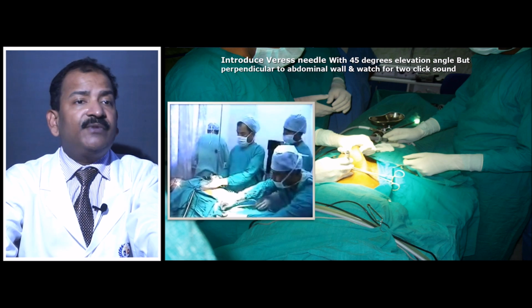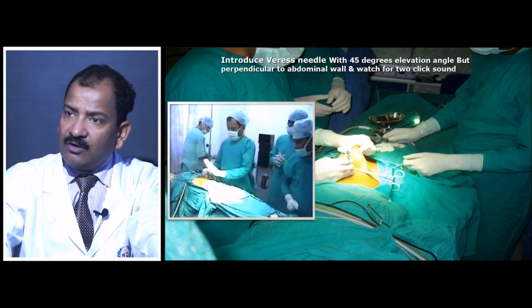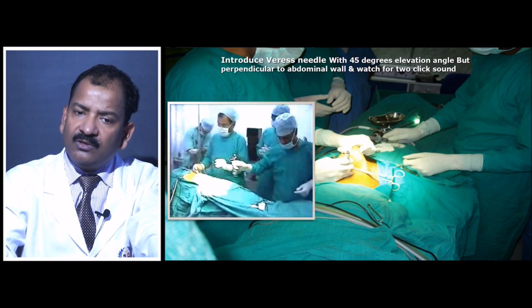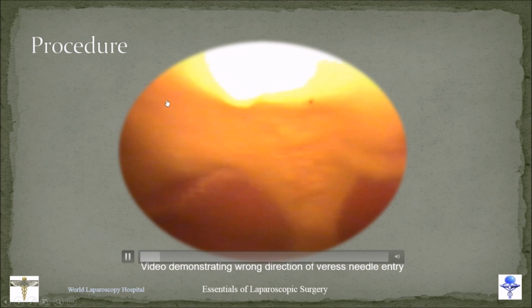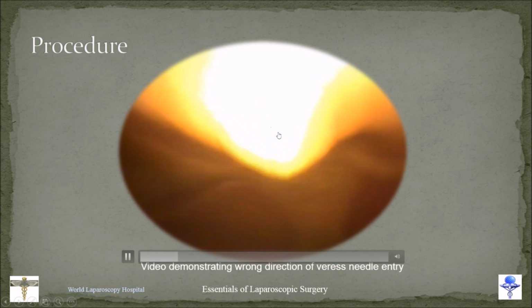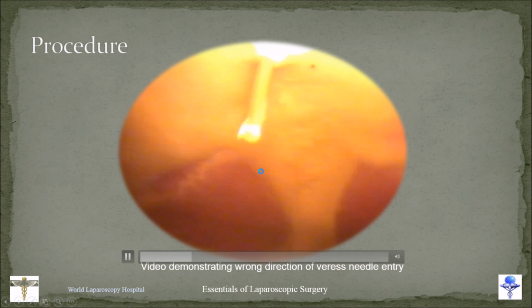What are those? The insufflator has the information I have already discussed yesterday. On Saturday I do not have to discuss this more, but as I told you, the length of the Veress needle should be 4 plus the thickness of the abdominal wall. Why? It gets tented. You can see here, this is tenting of the Veress needle, and after that much tenting, now it is punctured.